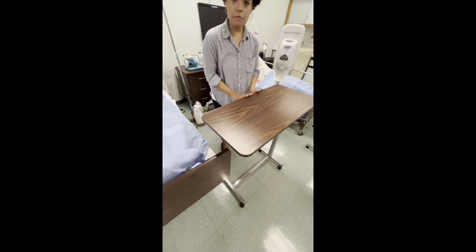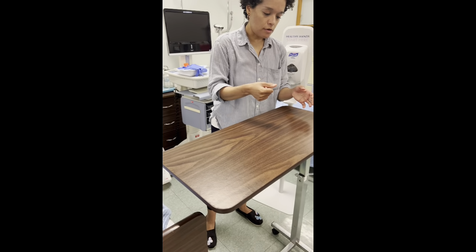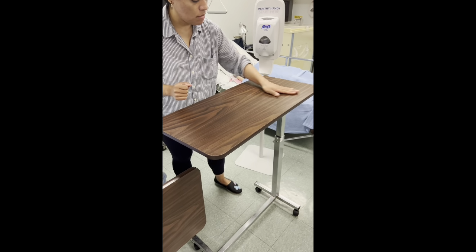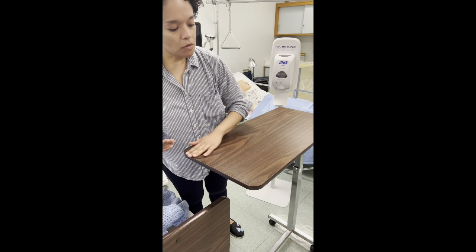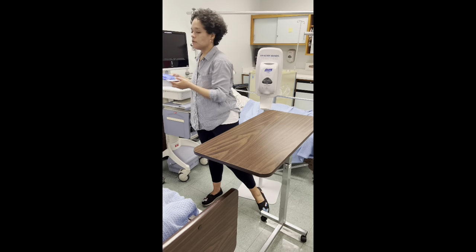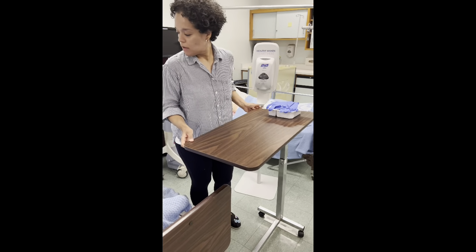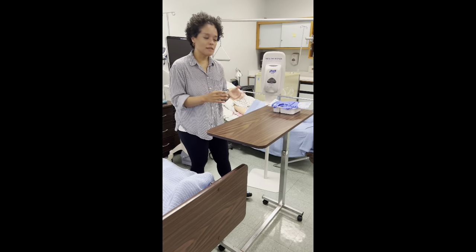Okay, so now I'm going to disinfect the table. This is where we're going to be placing our supplies. So I'm just going to use a spray. Okay, and I have a towel. Using a paper towel, of course. Okay, the table is now disinfected and ready for supplies to be placed. So I'm just going to place that in there. And here's our kit on our disinfected surface. Okay, and I will be washing hands next. So I will be washing my hands.